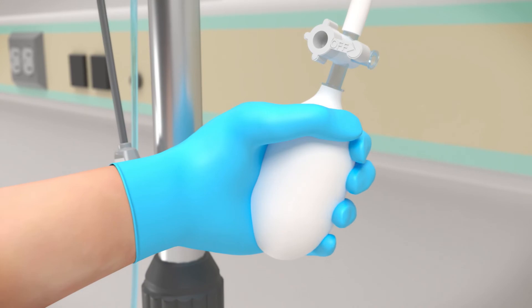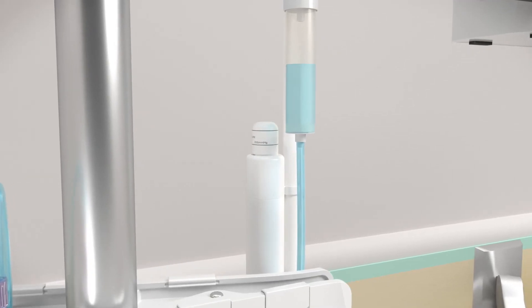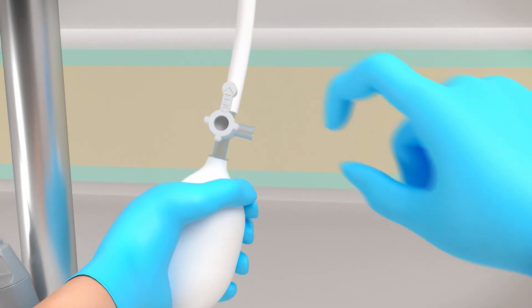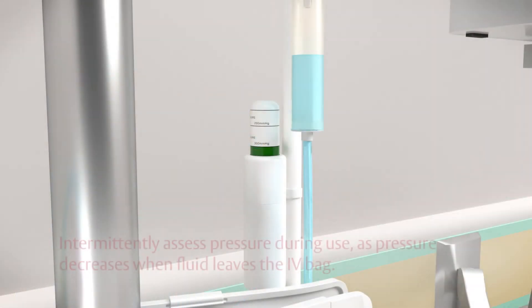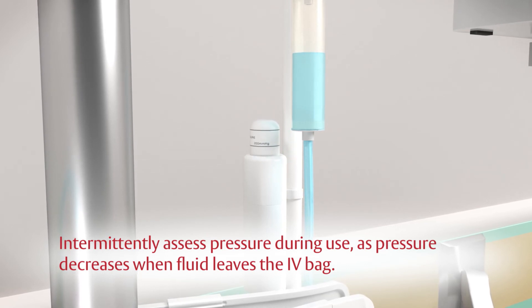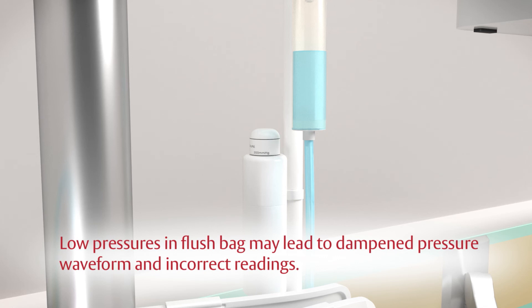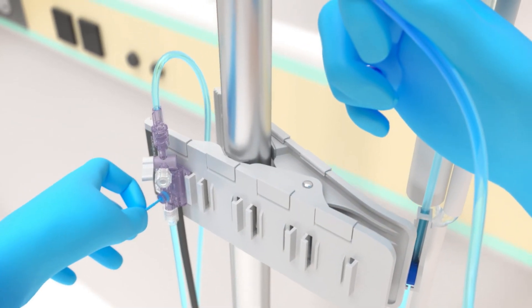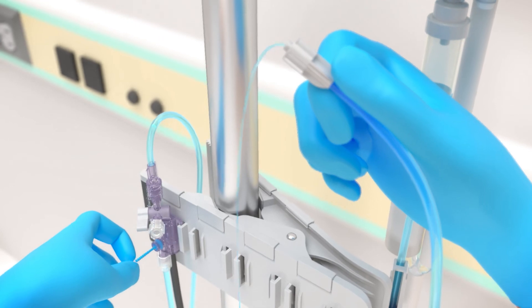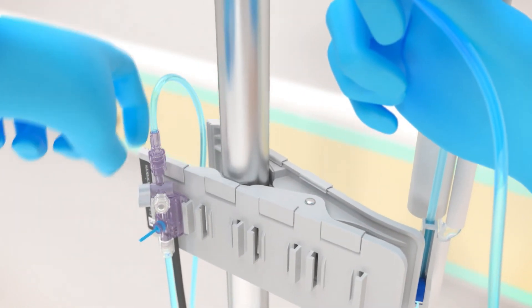Pressurize the IV flush solution bag to 300 millimeters of mercury. Turn the stopcock toward the pressure bag to lock off air pressure. Intermittently assess pressure during use, as pressure decreases when fluid leaves the IV bag. Low pressures in the flush bag may lead to dampened pressure waveform and incorrect readings. Pull the snap tab to flush the system under pressure, while tapping on the tubing and stopcocks to remove any residual bubbles.